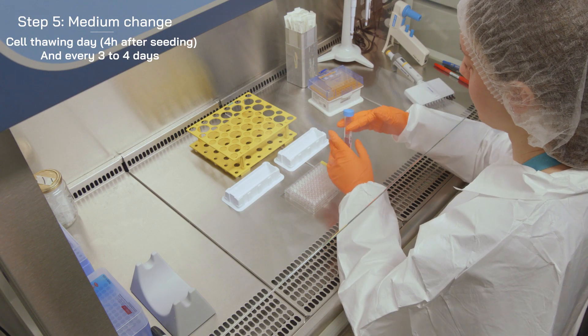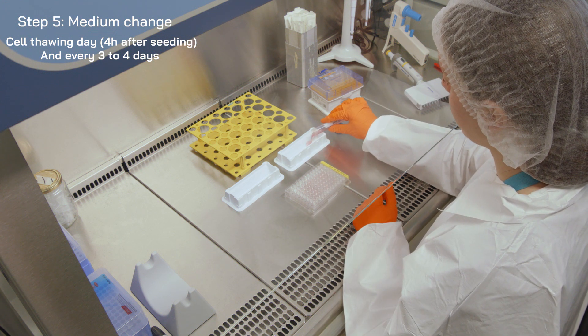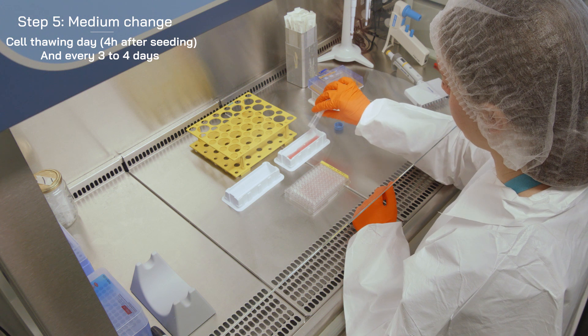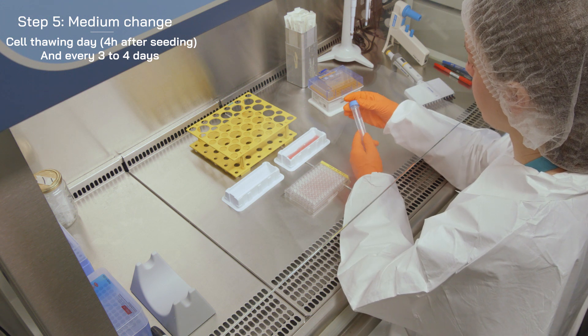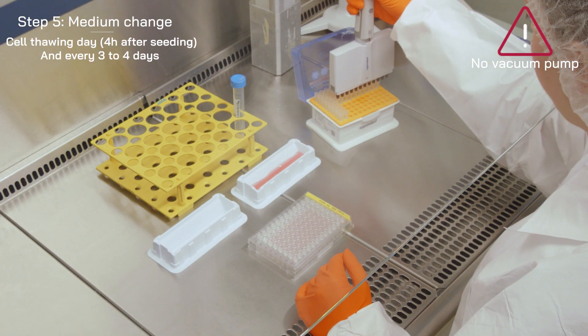The medium should be changed gently 4 hours after plating and then every 3 to 4 days. The use of a vacuum pump is strictly forbidden.